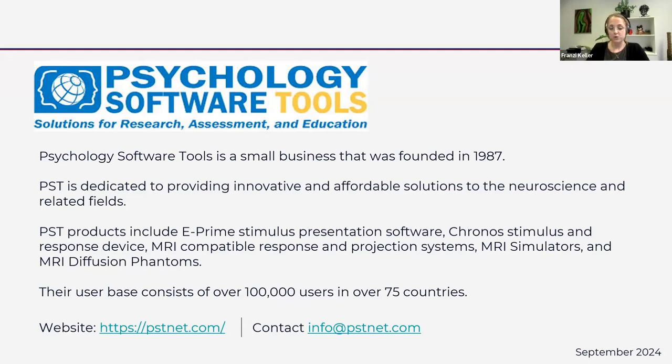The most well-known products include E Prime stimulus presentation software and the Chronos response device, both of which I've had the pleasure of working with myself as well. Also MR-compatible response and projection systems, MRI simulators, and MRI diffusion phantoms. They have a user base of over 100,000 users in over 75 countries, and you can find them on the web, of course, and contact them at the email addresses linked below.